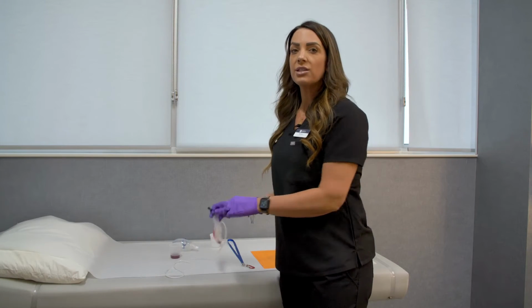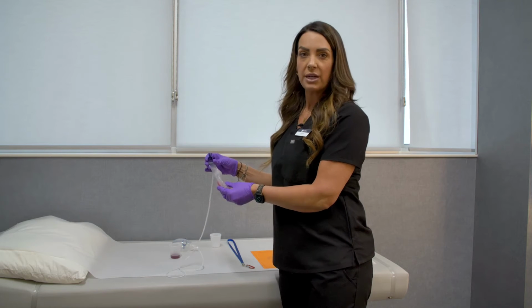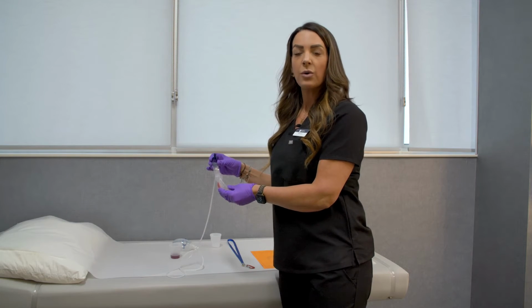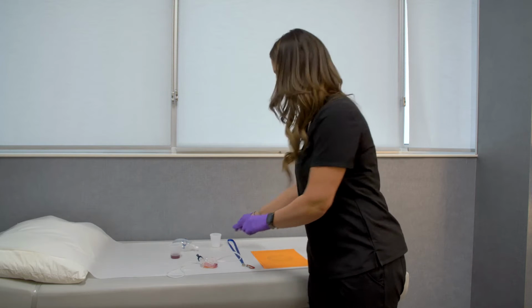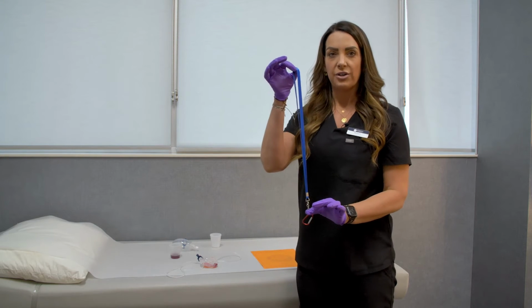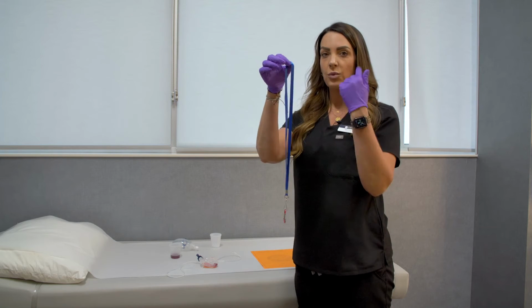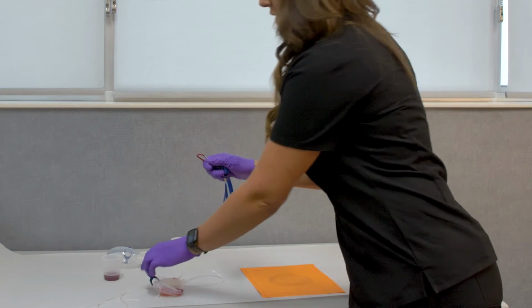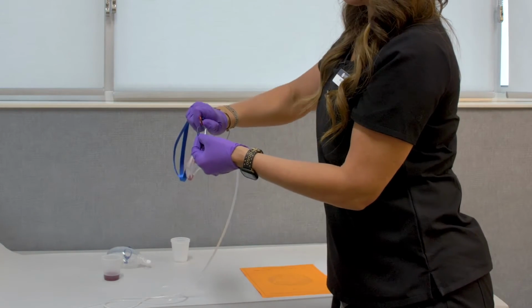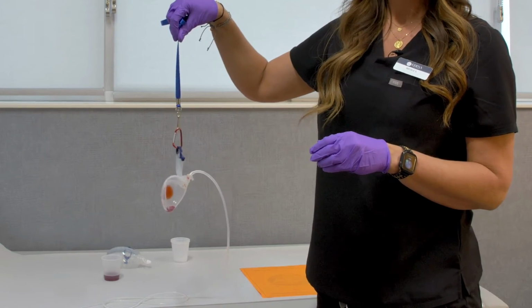So these drains will be hooked to the garment that you're wearing by this blue little clip here. There will come a time when you are able to shower after surgery. Since you will not have your garment on, we have supplied you with this lanyard. When you do shower, you're going to want to place this lanyard around the neck area, and then clip the drain onto the lanyard. So this is what you will wear when you're in the shower.